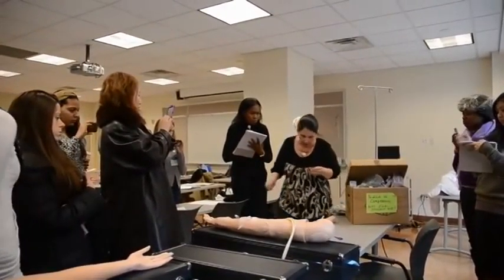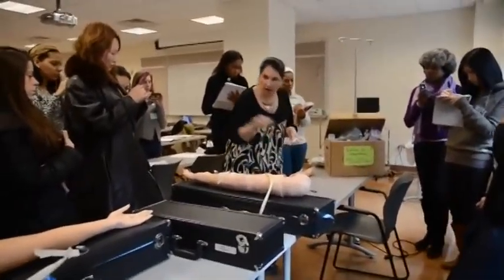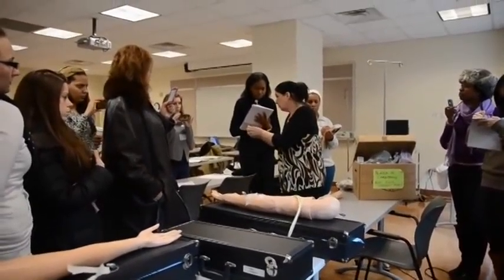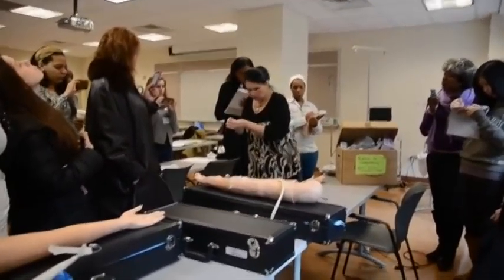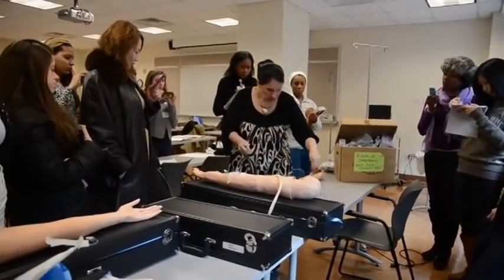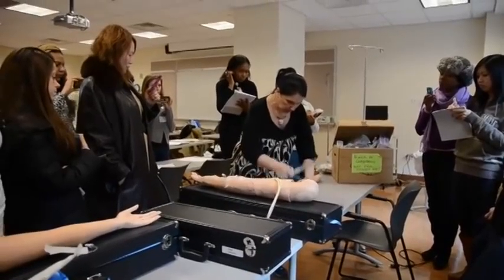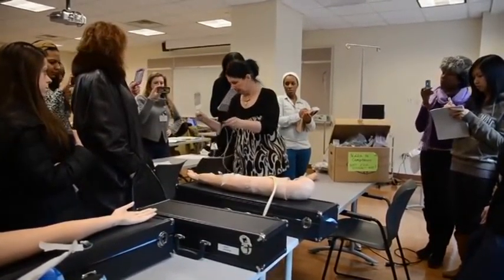I go to my table, I find my alcohol wipe. I'm going to take two of these. You don't have to flush anything. I'll have two alcohol wipes. I need my bag, and this is a 50cc bag.